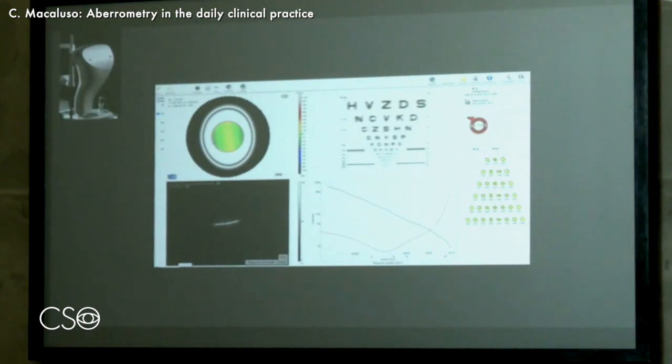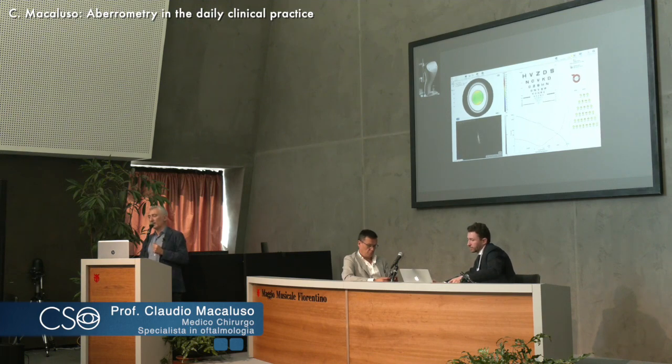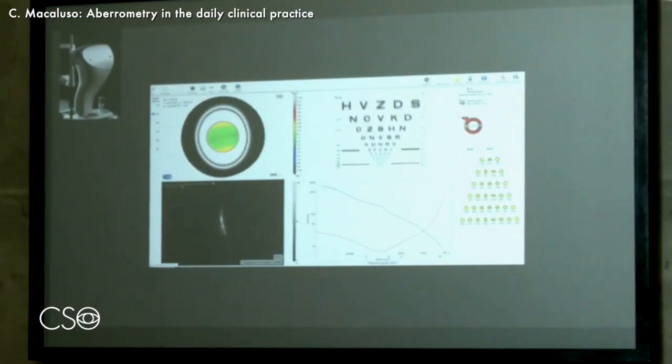All of us have studied optics and imagined how the focus lines are at the extremities of the Sturm's conoid, but here we can actually see them in the real eye of the patient. So this is one. We go to the other extremity of the Sturm's conoid, we get the perpendicular one. And this is not just something playful for us, which is nice, I like it, but also with patients it's very useful. So we can show them what is the effect on visual acuity of this distortion. And in counseling, for example, for toric IOLs is an extremely useful tool.